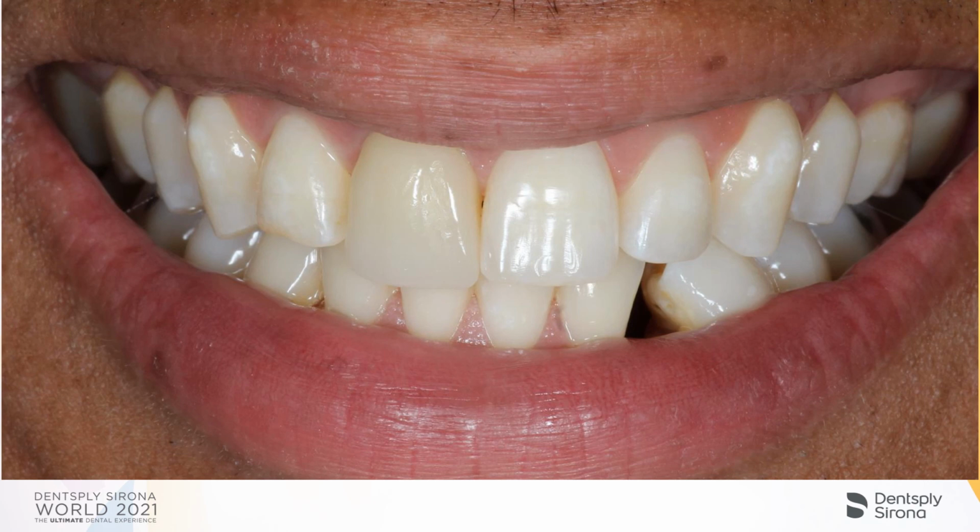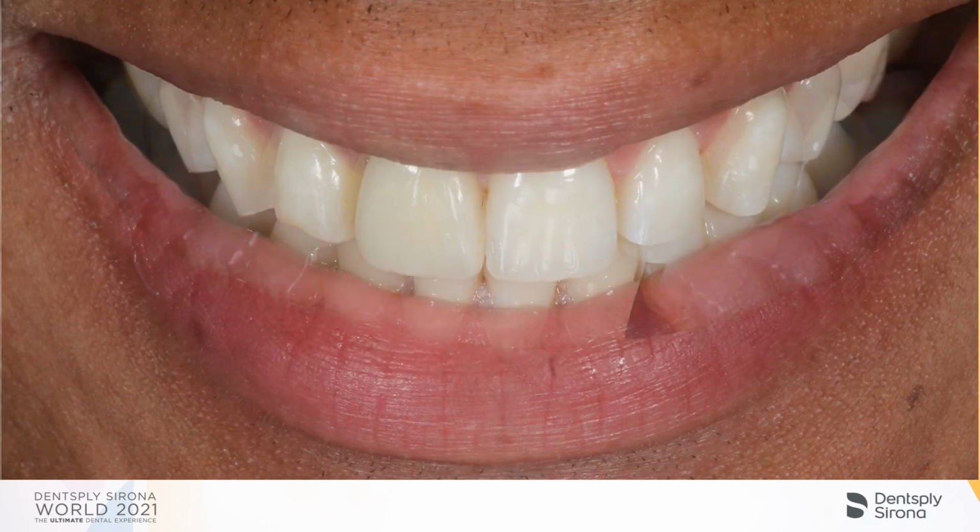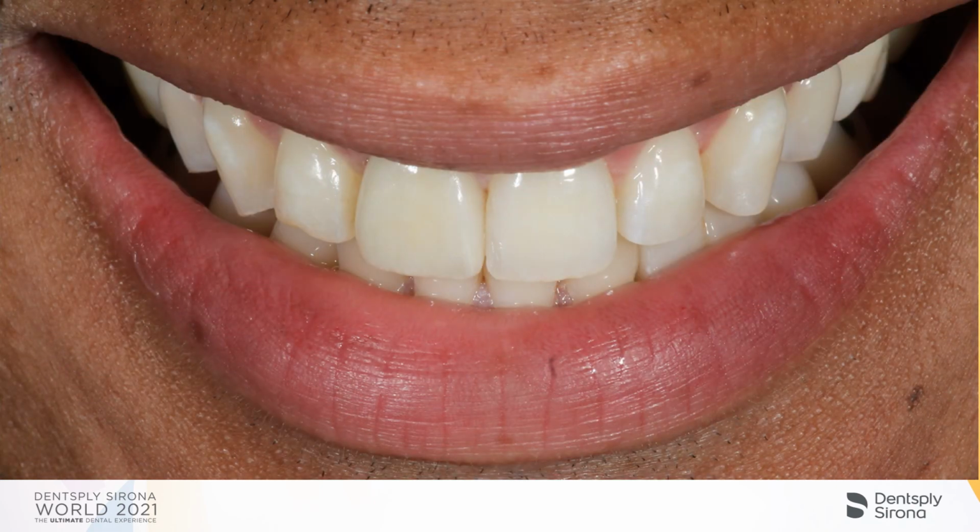So to wrap this presentation up, we wanted to start with how this patient presented and their chief complaint of a dark, long tooth that they did not like in the anterior. And in a single 2.5 to 3 hour appointment, I wish I could tell you exactly how long it was, we end up with this result.